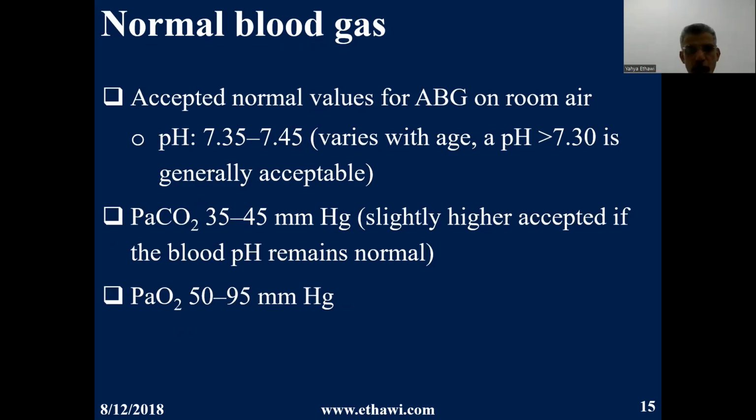You will see, when we work together, that there is an acceptable blood value. These numbers are just for research and documentation. In reality, we have permissible or acceptable blood gas results rather than normal blood gas results, depending on the sickness level, gestational age, and postnatal age. There are many factors we consider, even if the blood gas number is below the reference range that we have.